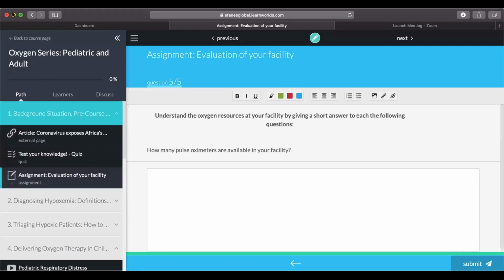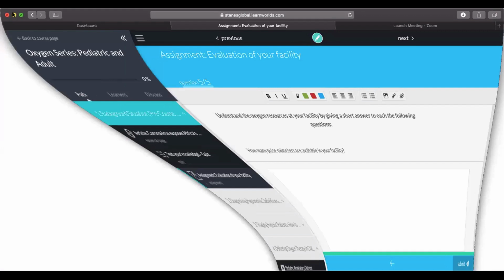With the nasal cannula, it's unable to hold that reservoir, and basically all of the oxygen that you're putting in through the nasal prongs will collect within the patient's nasal cavity area, the nasopharynx, but everything else will pretty quickly diffuse out into the atmosphere and doesn't get held on in the same way. So with a non-rebreather mask, there's much less respiratory effort needed to get a higher concentration of oxygen. So we can go through different oxygen delivery devices.